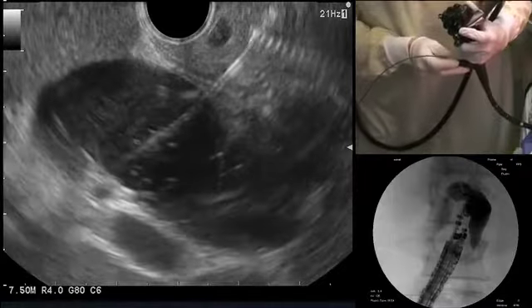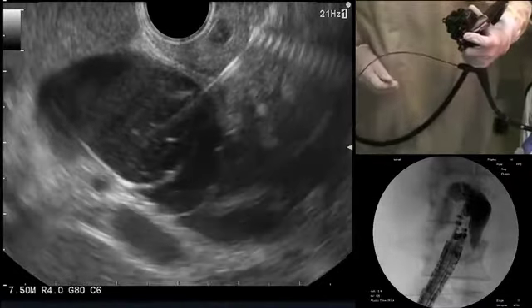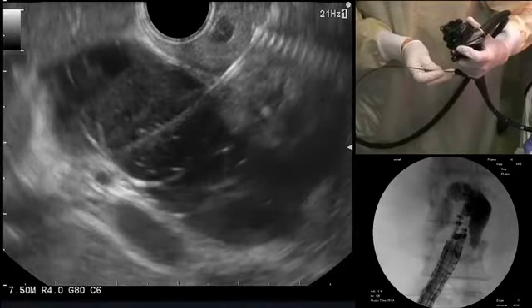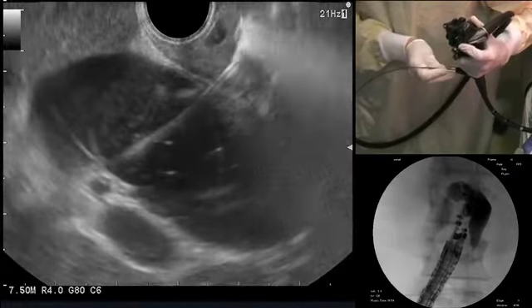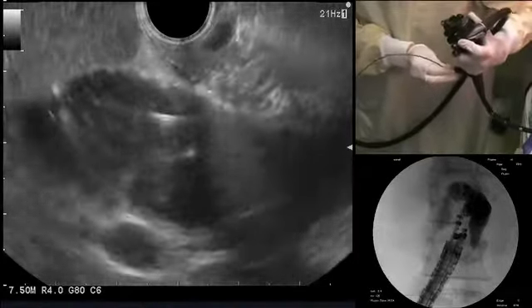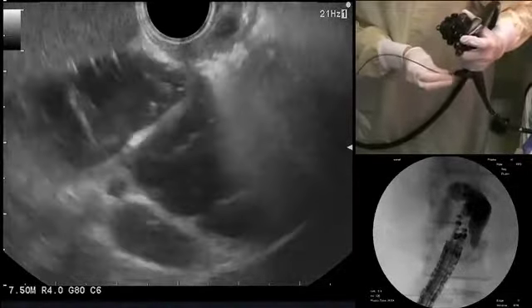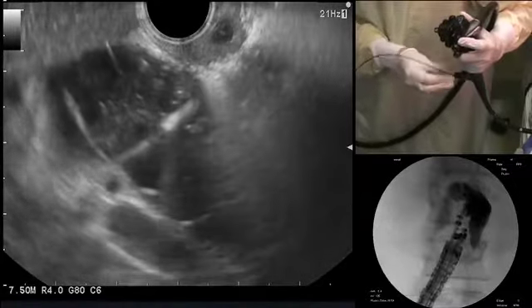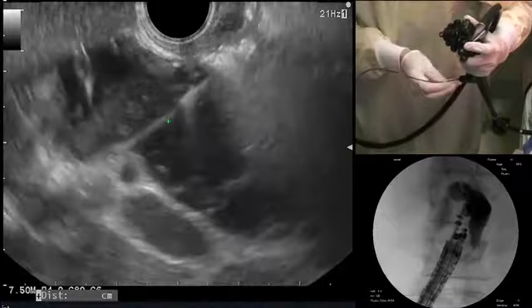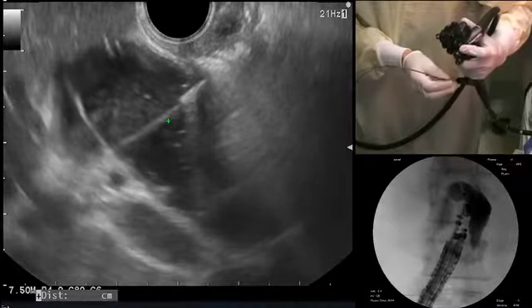We're going to use pure cutting current — that's very important to use pure cutting current. So we're ready now to burn through the wall. And I'm through, I believe. I'm going to check and make sure that I'm through. Yes, there it is — you can see very nicely the tip of the cystitome here. So I'm through. One could also use fluoroscopy, but there's no need for that right now.